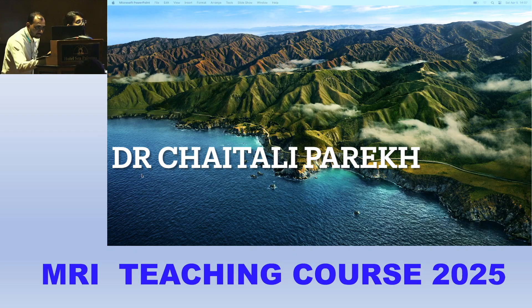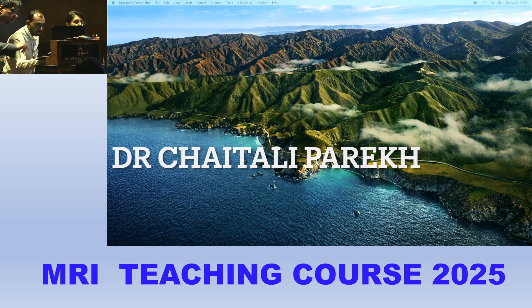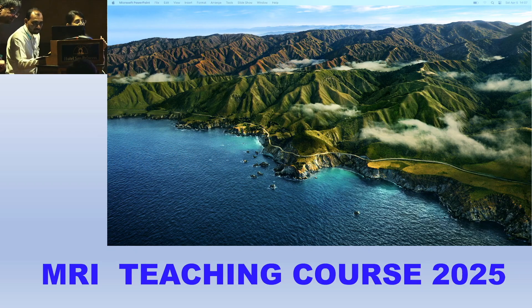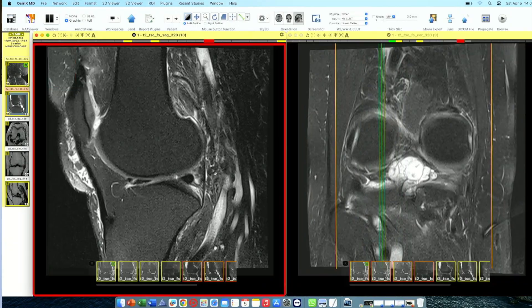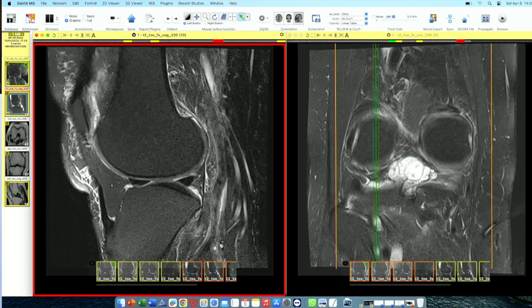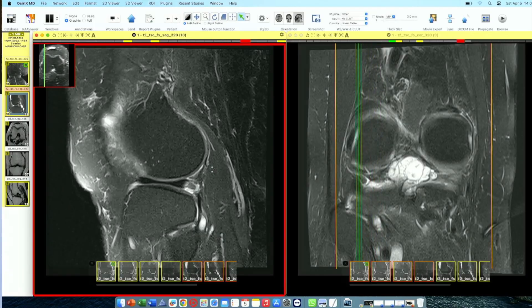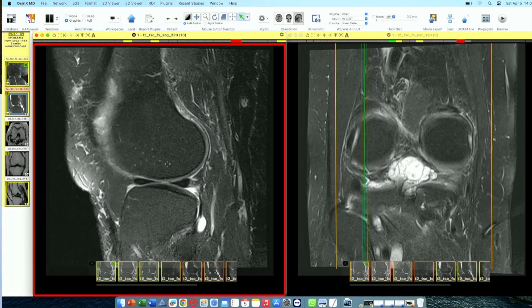I'm going to show you four cases — some are basic tests and some are complicated. We'll have a short discussion of each. I'll be scrolling and will put an arrow wherever I find the pathology for you to understand better. This is a sagittal T2 fat-saturated image, and this is the lateral meniscus because this is the lateral compartment.